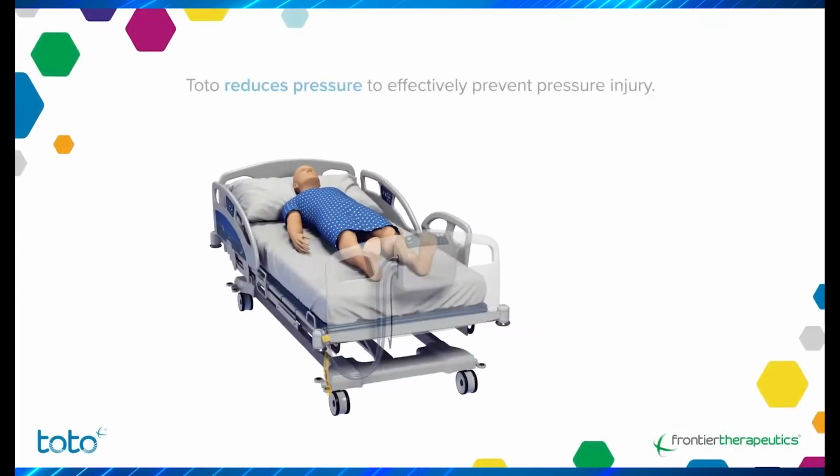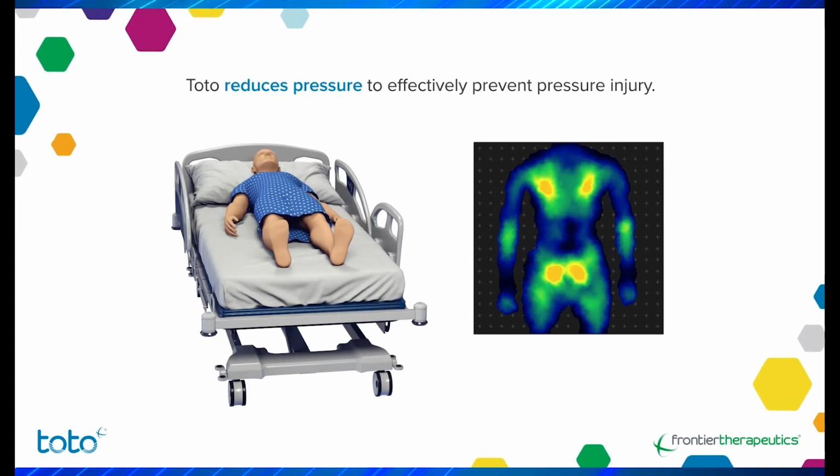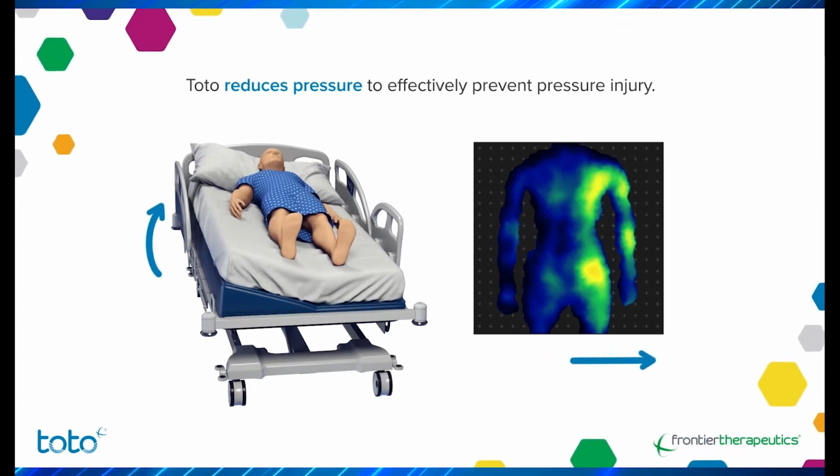Yeah, and I'm sharing an image right now that's from one of the videos that's on YouTube from Frontier, and it's showing the pressure mapping, because in my mind, when we look at the NPIAP or the EPUAP guidelines, it tells us 30-degree turns every 2 hours while in bed is the gold standard. But it doesn't really say manual turn, but how else would you know, right? Like, how else would you do that? And I didn't even know this innovative technology existed, but to show from a pressure mapping standpoint that you are truly offloading the patient, I think is really that gold standard.